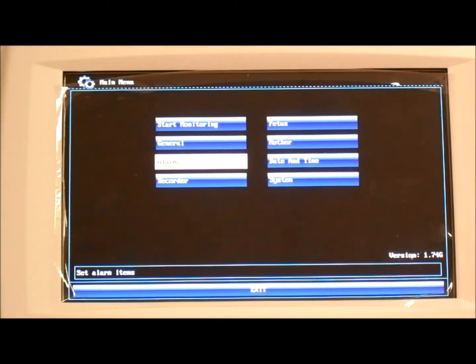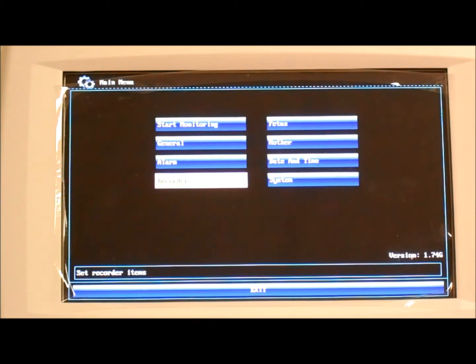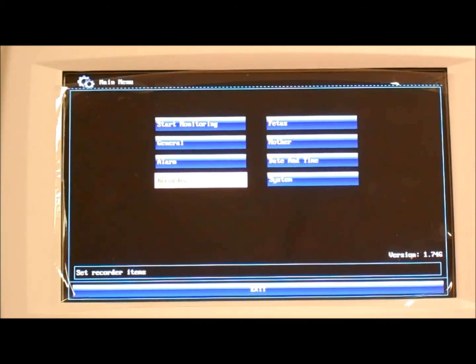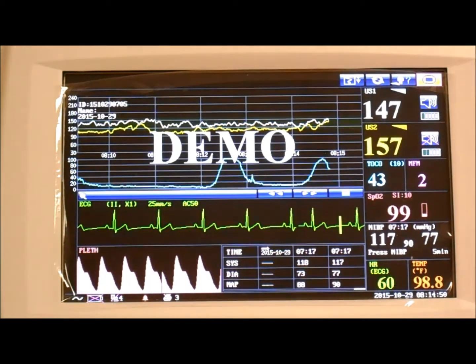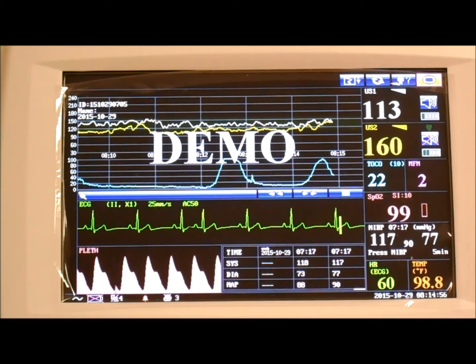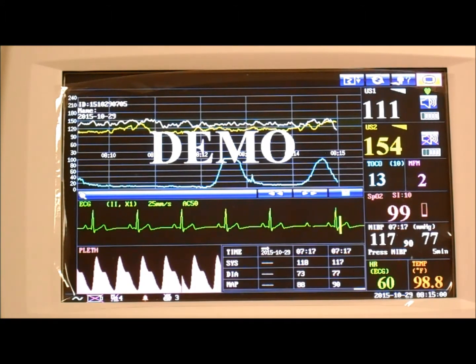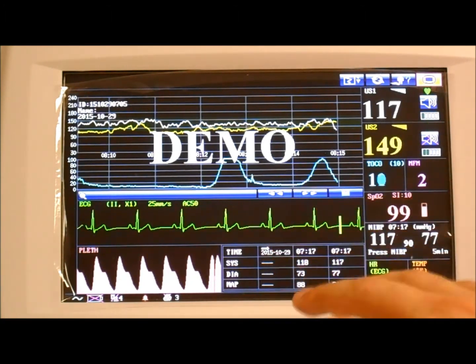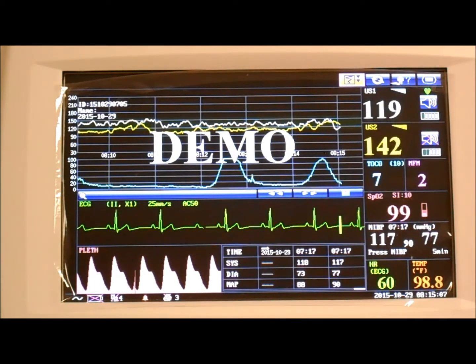Okay, now we have the monitor ready, and these are a one-time setting application only. So if you turn off the monitor, turn it back on, those settings will remain. So we press exit. Okay, so now we're ready to use the monitor, and the actual operation of the monitor is very simple. All you do is you place your sensors and transducers on your patient, and the monitor automatically starts taking readings and giving you a waveform. There's no need to activate or start anything.